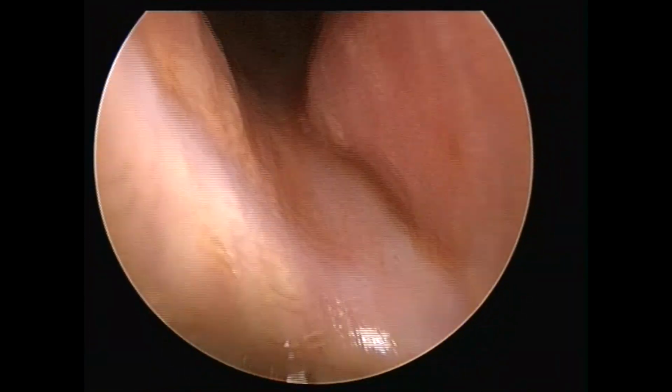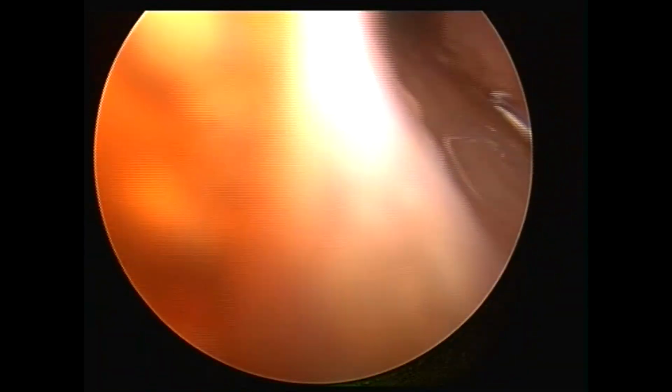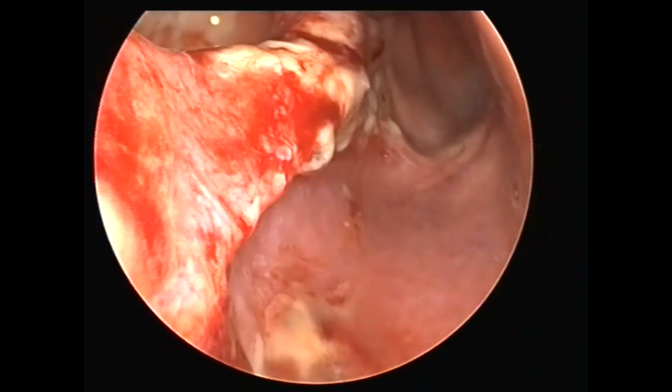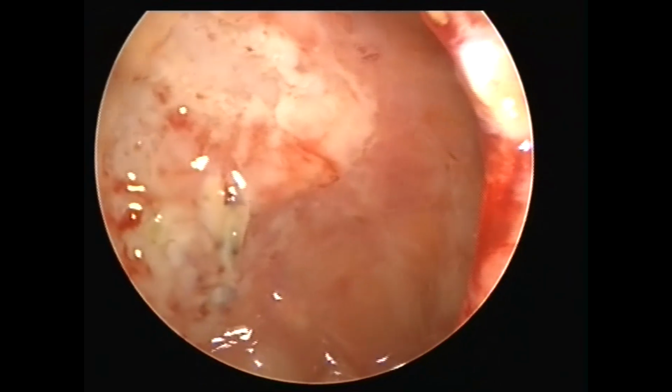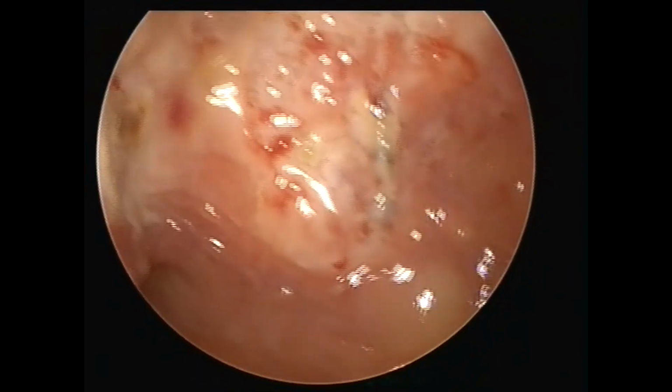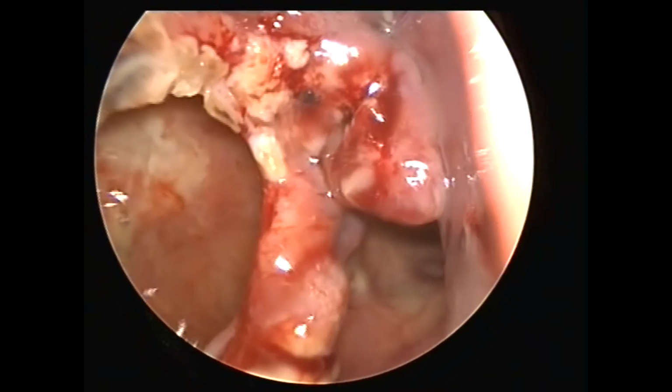The easiest way of examining the most narrow and blind areas of the maxillary sinus. You just have to keep the 70-degree endoscope facing downwards and carefully go inside the nasal cavity, as I'm doing right now. And there you can see that's the posterior wall, anterior lateral wall. That's the most anterior aspect. You can see even the anterior inferior wall of the maxillary sinus along with the roof, all in one image. That is 360 degrees.